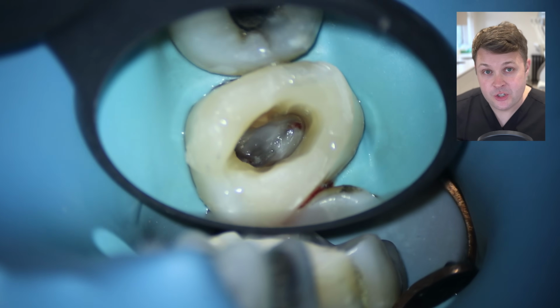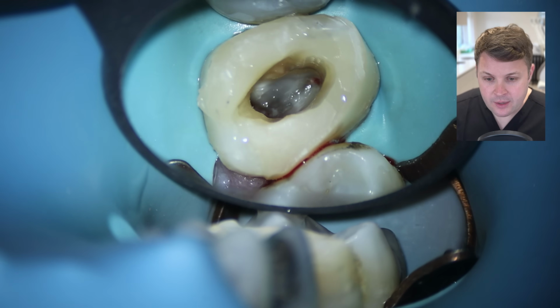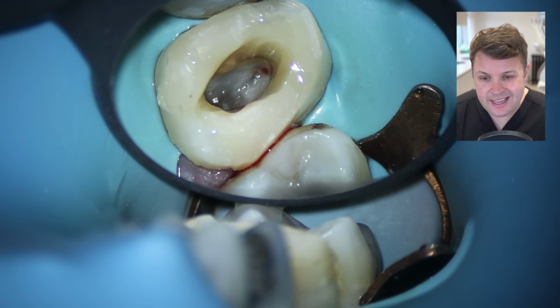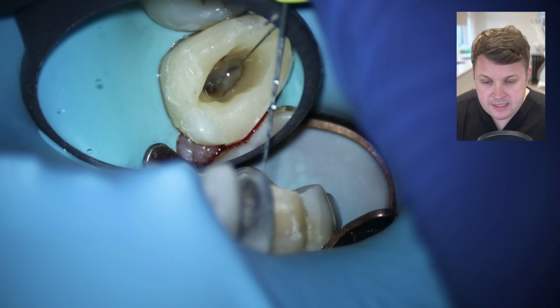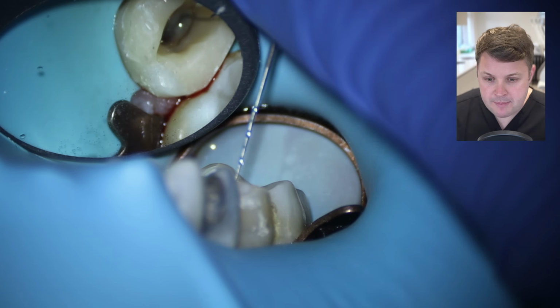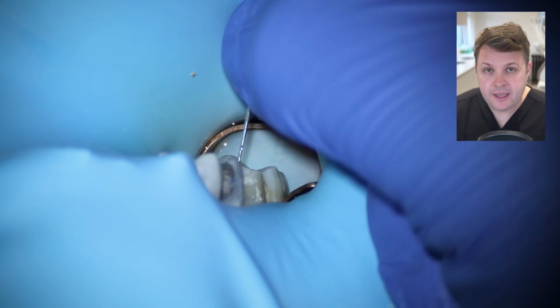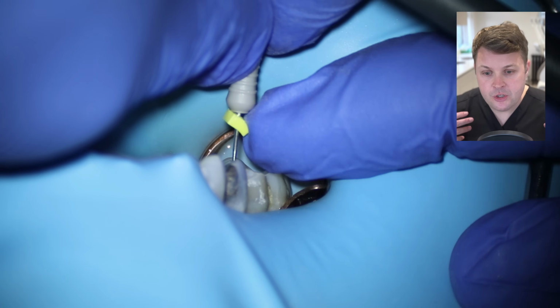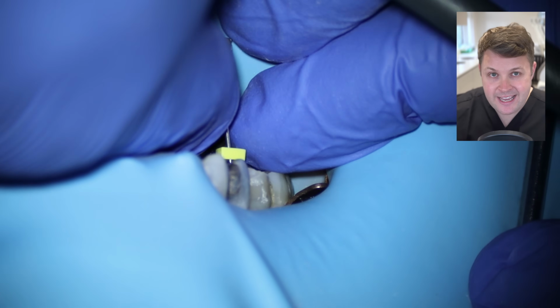Because the size 10 K file isn't reaching down into this MB canal, I'm going to step down to a size 8 D-finder, and I have a little watch wind with this. Again I feel like it's getting a little bit of resistance, so it's not going too far. So I move the stopper to the furthest point we've reached and measure that, and then I'm going to use a succession of higher diameter files, not past this amount. The furthest point we've reached is 18 millimeters.